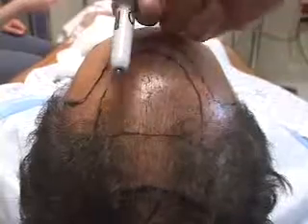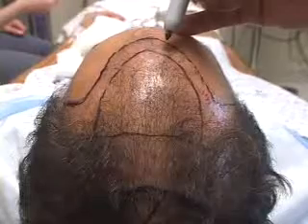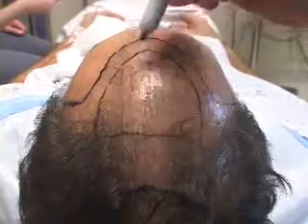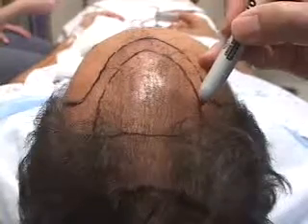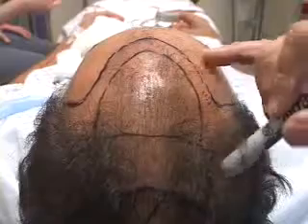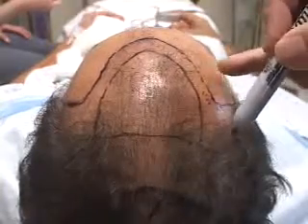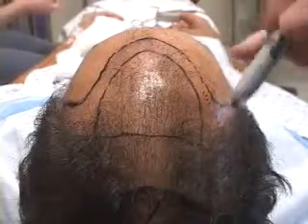As we go back, this is the mid-scalp. And the mid-scalp should also be forward, just like we're showing in the anterior hairline. These grafts are going to be using our combination graft technique, which is going to be much higher density. So there's really almost no see-through effect in the central zone. Again, there's going to be a little splaying, but remember that the splaying has to be only in the lateral centimeter right here, and that's going to transition into the area called the lateral hump, which is right here. You see this little curvature. We're going to turn the head in a moment to show you exactly how that transitions over better, but we're going to go back and talk about that in a moment.